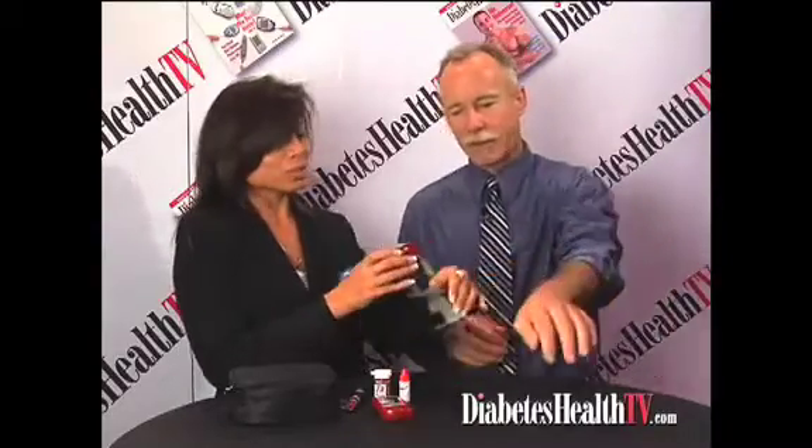What we do is simply place the cuff over on our wrist. Are you going to do me? Sure. Press it firmly enough. So it does blood pressure, and it'll measure my blood glucose as well. So I lay my arm down. Does that feel okay? Yeah. You activate it by pressing that button right there. Now you cannot speak — you should be relaxed, and then you have to place it over your chest.